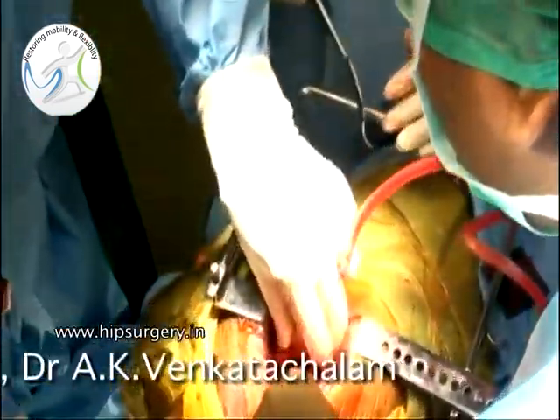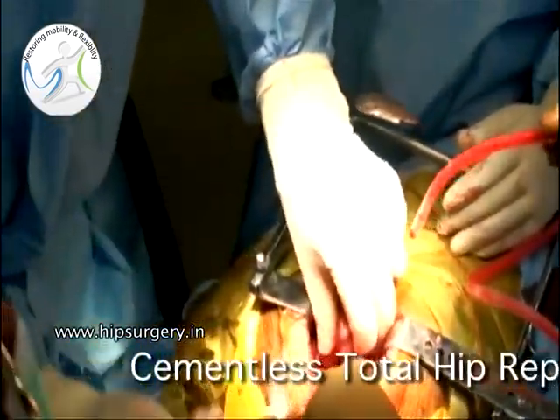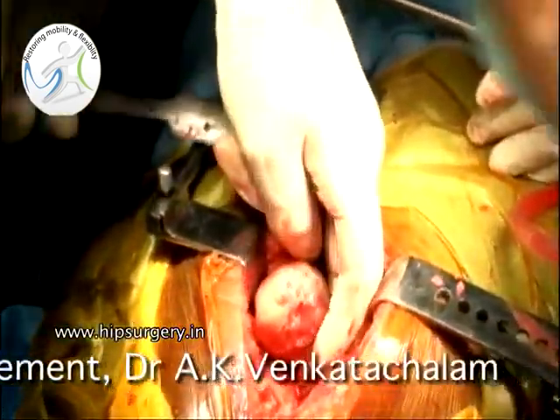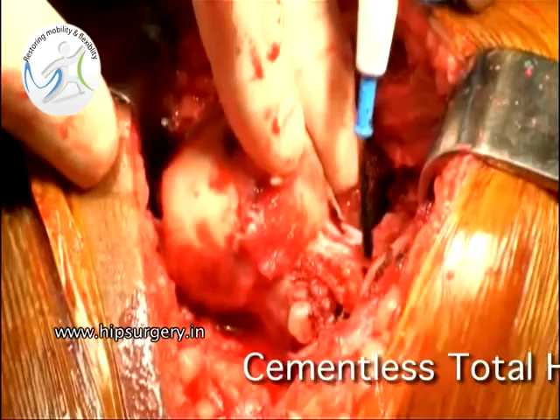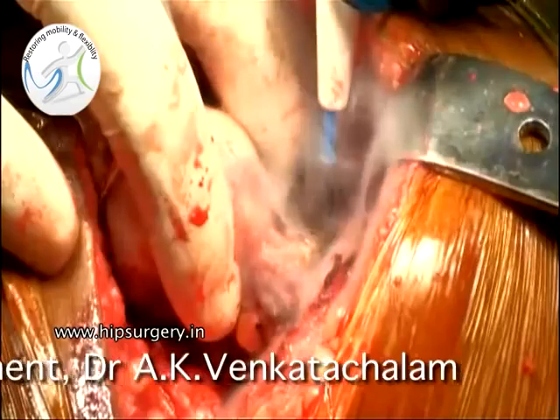After removing the head, exposure of the acetabulum is obtained. All the soft tissue attachments to the neck are divided and the head is preserved for obtaining bone graft.